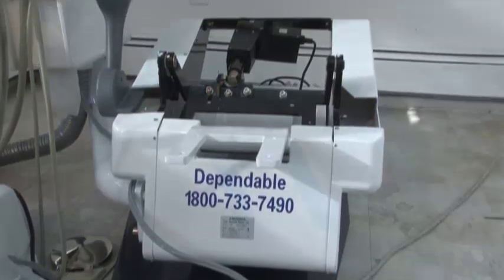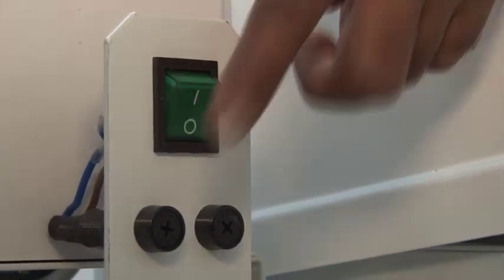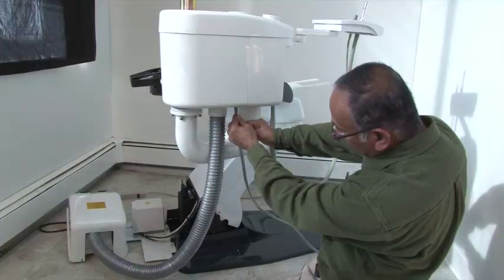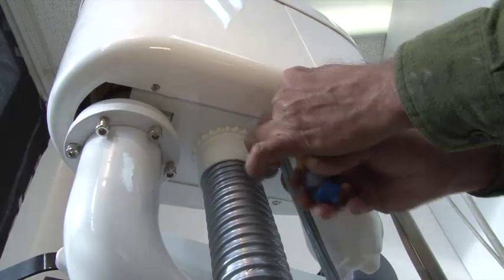Once the chair is raised to the highest position, make sure to turn off the main power switch and unplug from the outlet. Using a screwdriver, remove all six screws and carefully remove the covers.